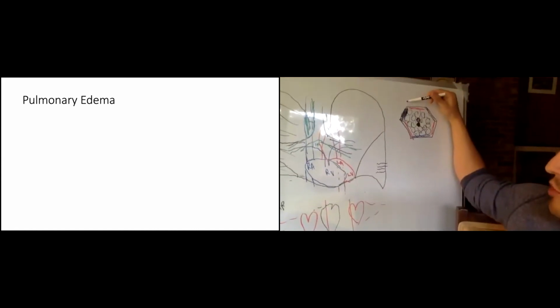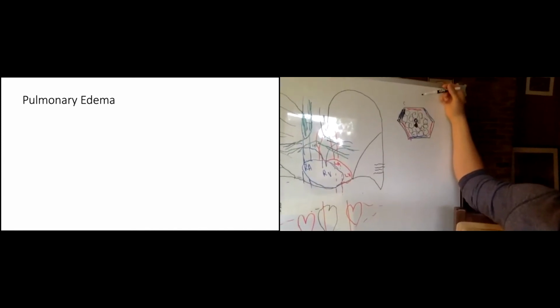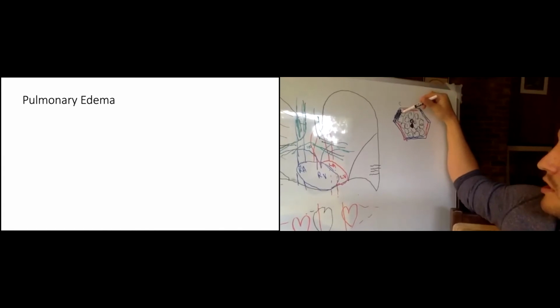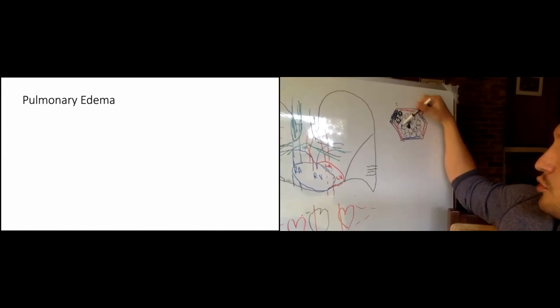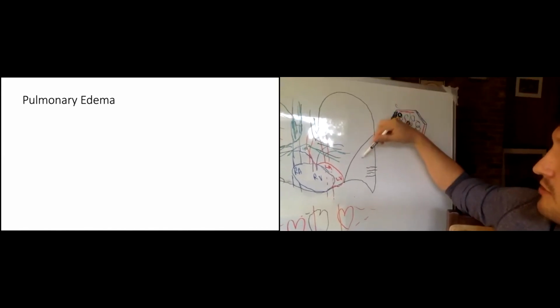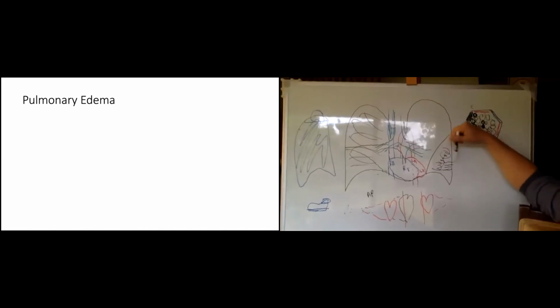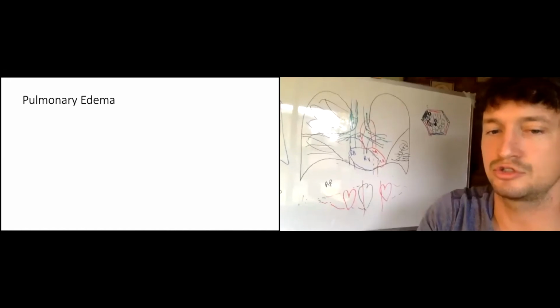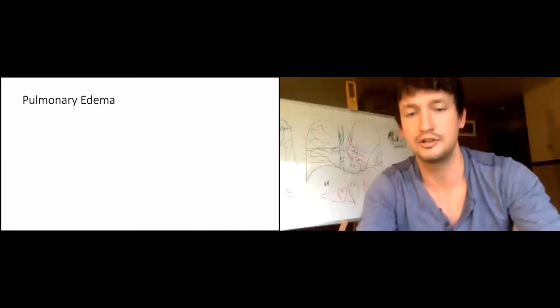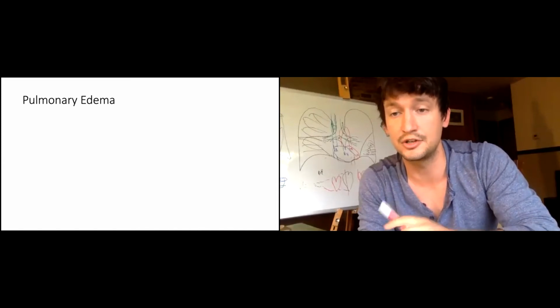When the pulmonary capillary wedge pressure gets even bigger, I think over 25, then you're going to start seeing these alveoli fill up with fluid, and then you're going to see the fluffy airspace opacities and more of the pleural effusions. Great, you guys just drew your first secondary pulmonary lobule, and they're really cute things. Let's go to the next slide.